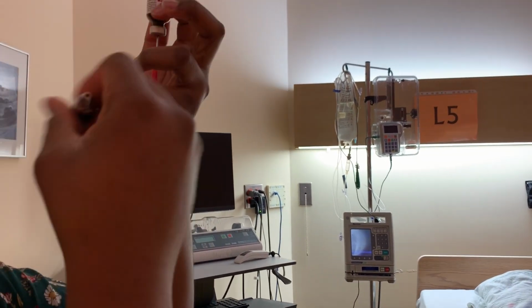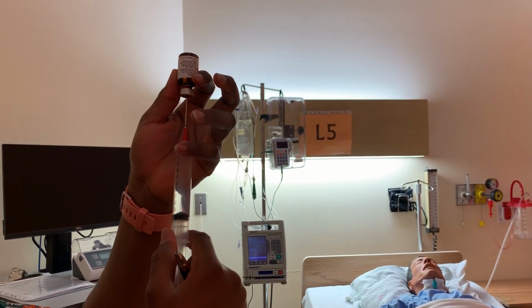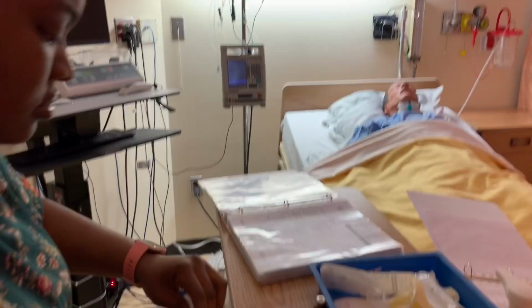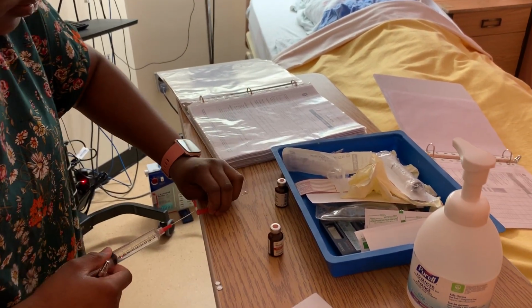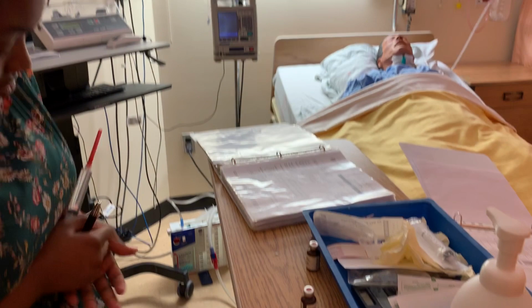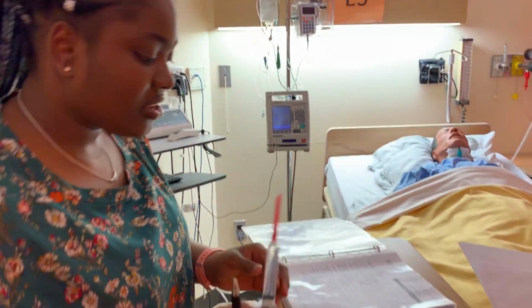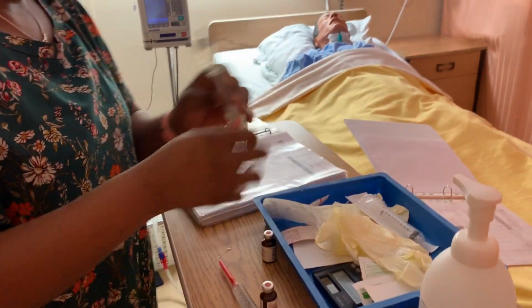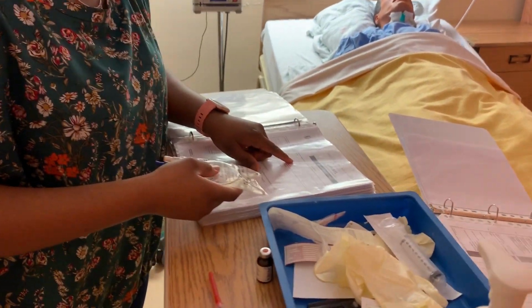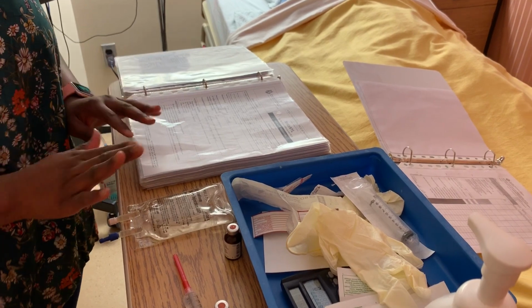Good. So I have up to 10 mLs here. So this is 10 mLs. So that's good. So now, it says I should use normal saline. So this is a 50 ml normal saline bag. So I'm gonna take out 10 mLs from this.